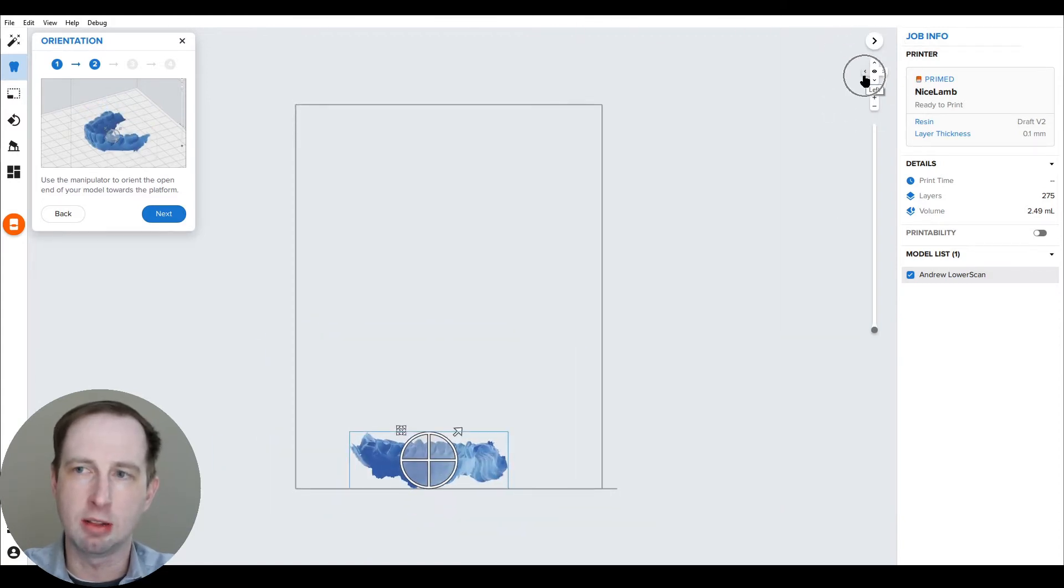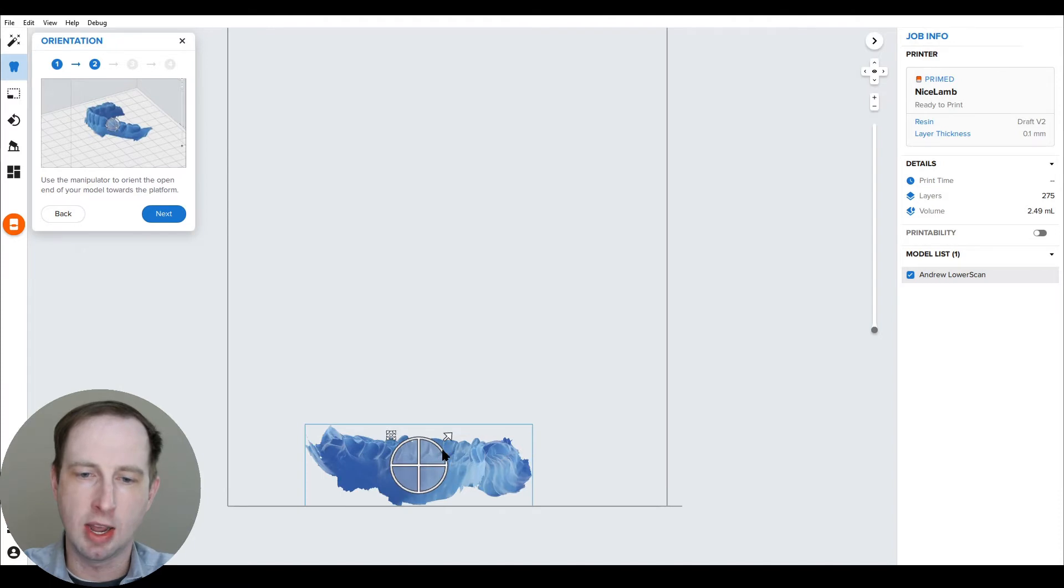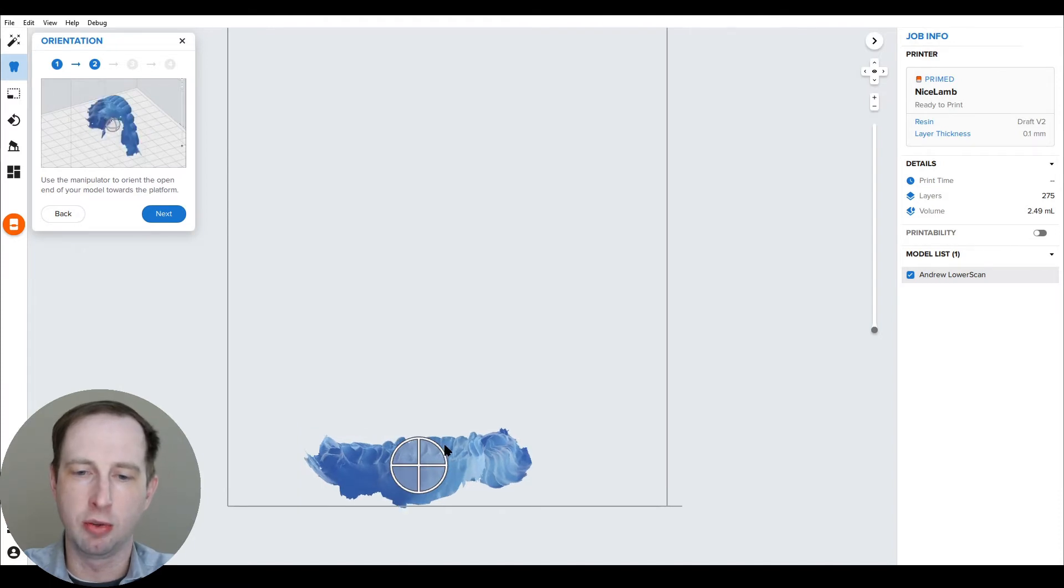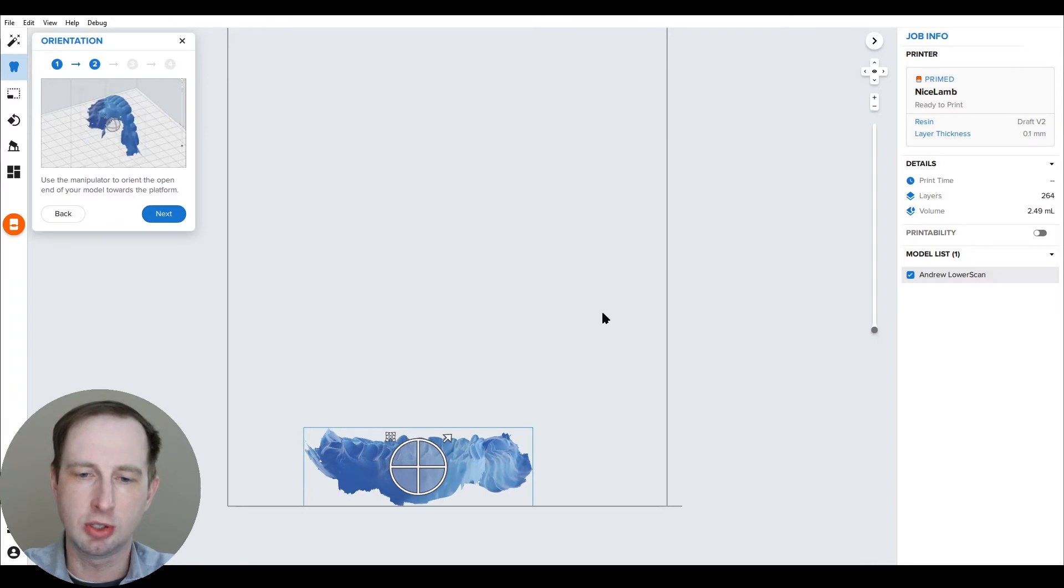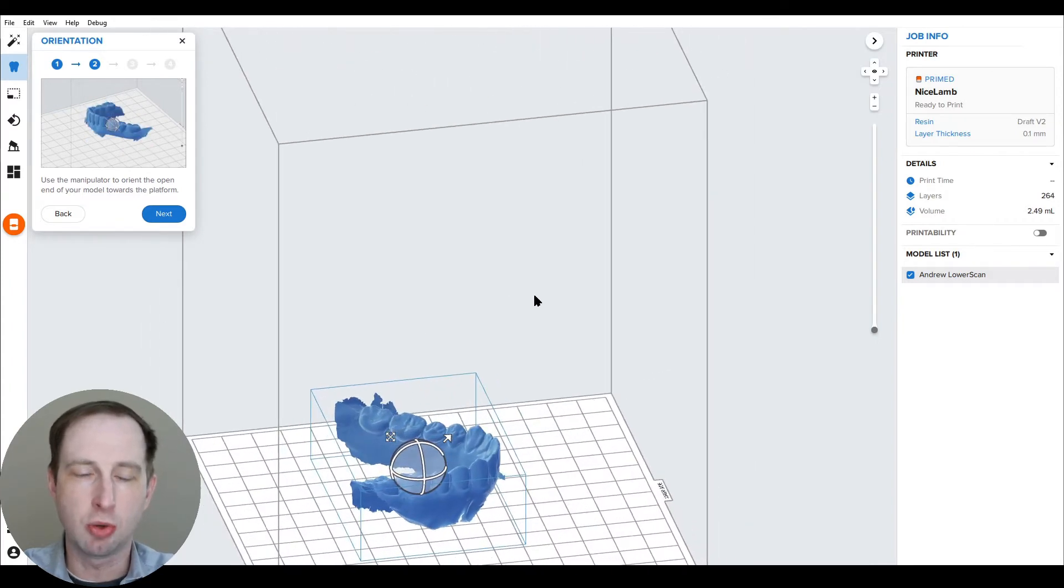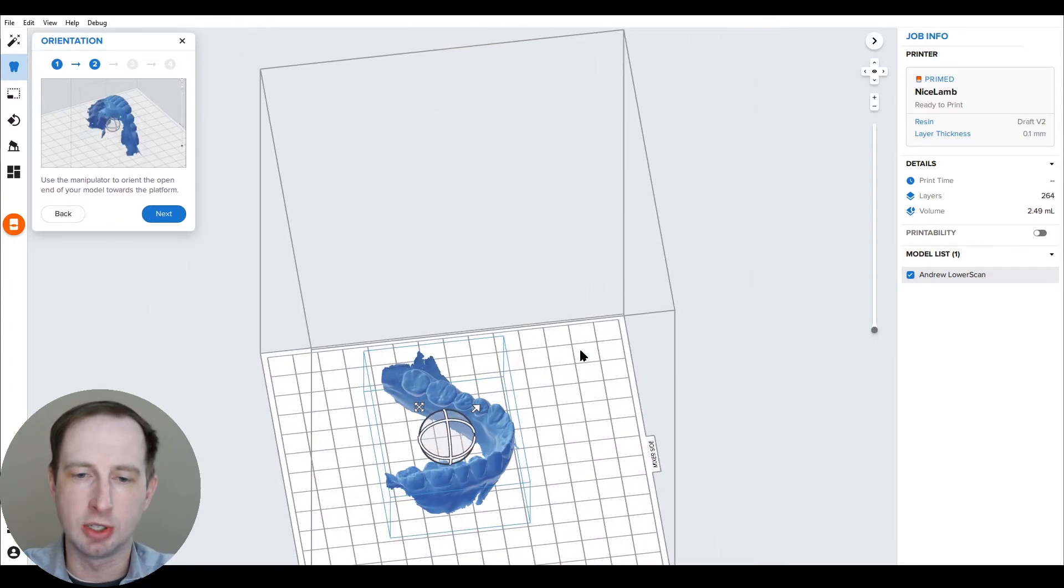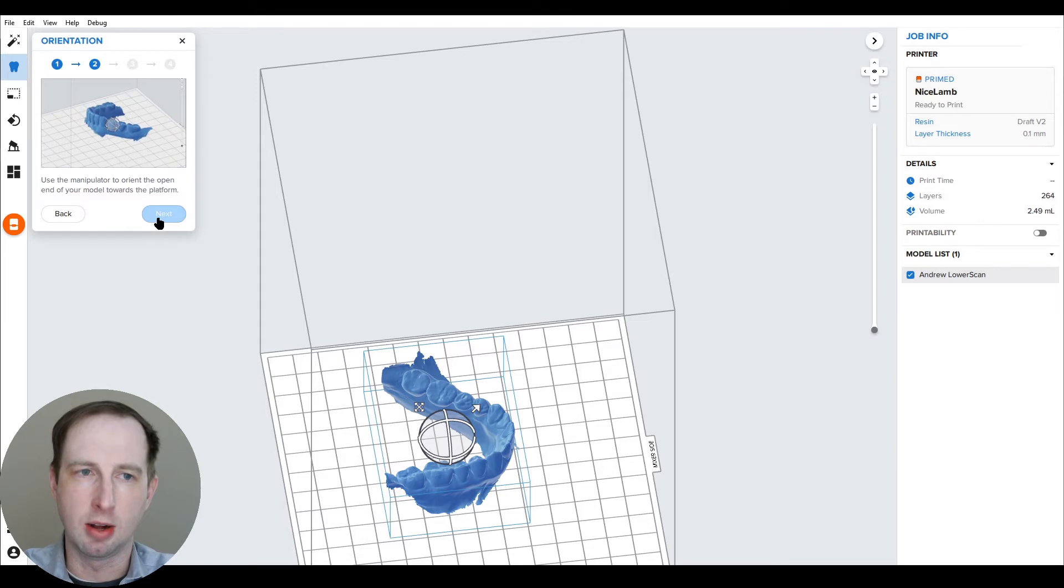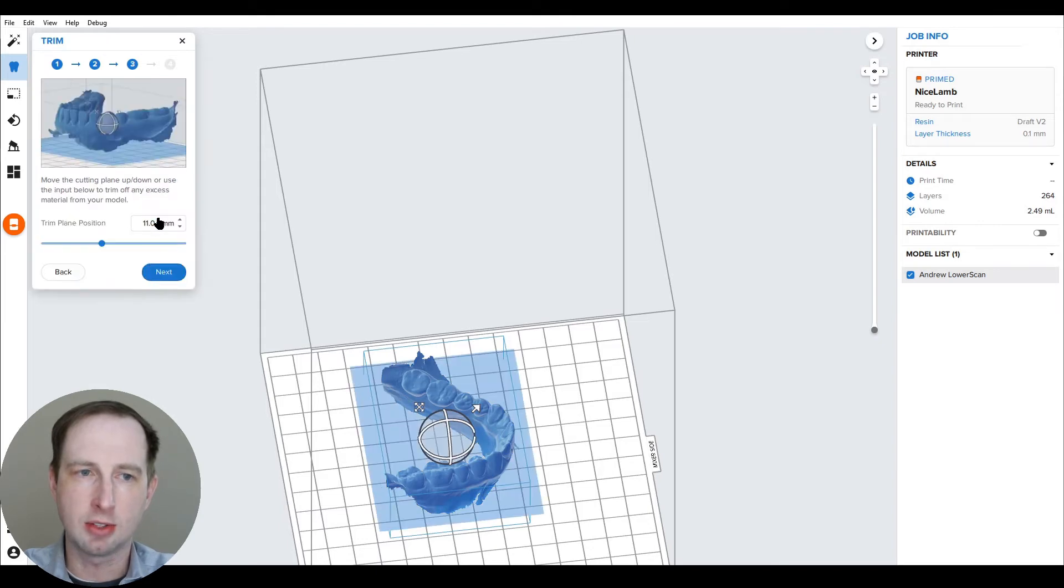It snaps you down to a side view, and now you can make really minor adjustments to the angulation of the arch and occlusal plane. Now I'm hitting the left button on the view here and I've rotated over and now I can see it from the molar side or the rear side of the arch. I can position it just a little bit better. So now that it's in position, you hit next.